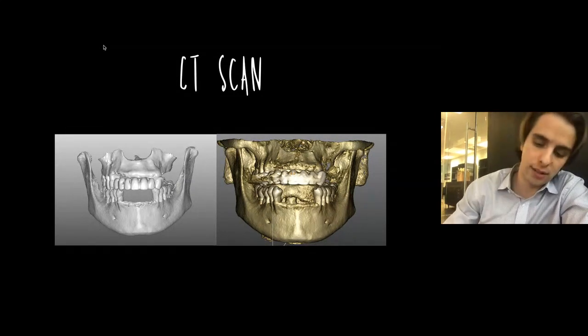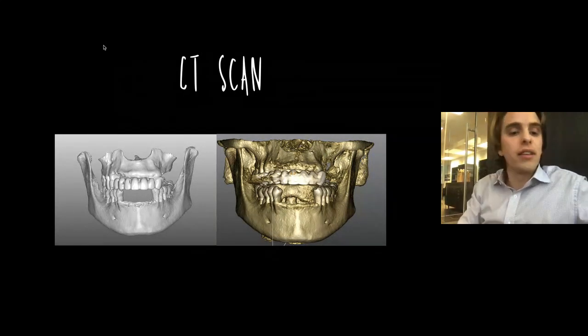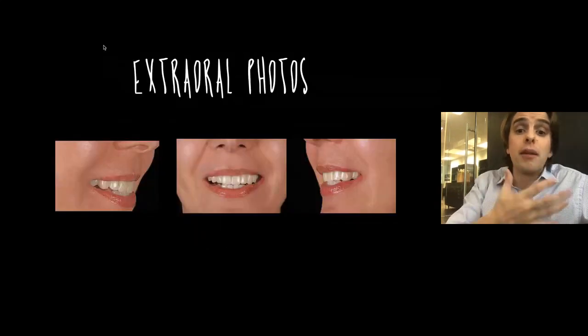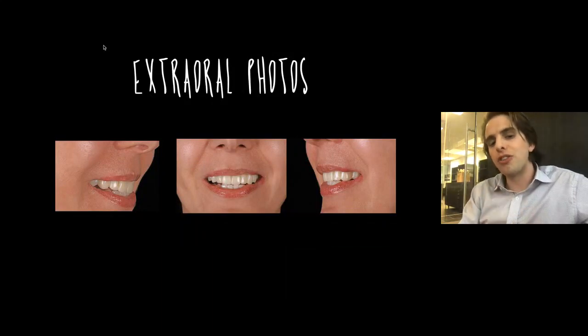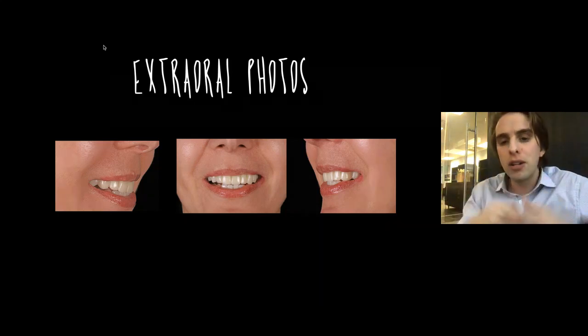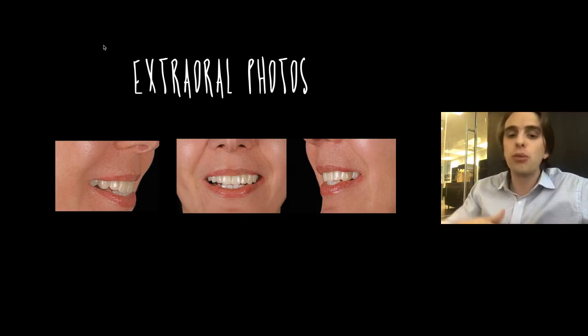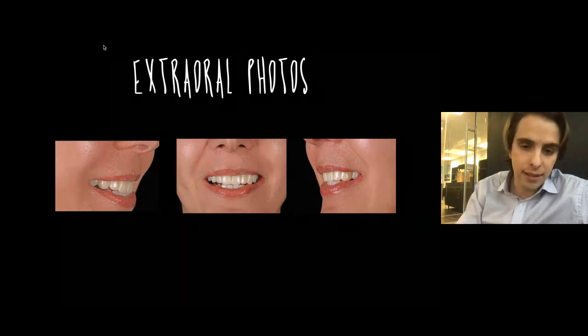Very, very important step. And I believe we're one of the only ones on the market that have this technology integrated completely. We need some extraoral photos of the patient's situation so we can start to understand some of the aesthetic motifs at play. What I see here is two laterals that are rather monolithic, preventing light to come into the structure. The partial removable denture appears to be canted, which gives the impression that the lip line is receding on the patient's left-hand side.